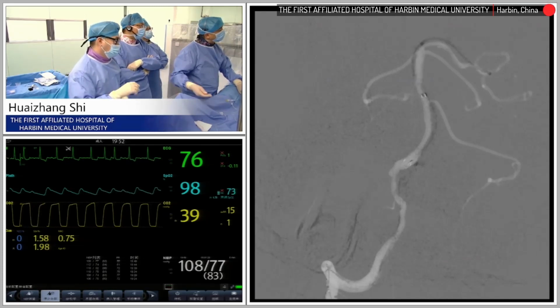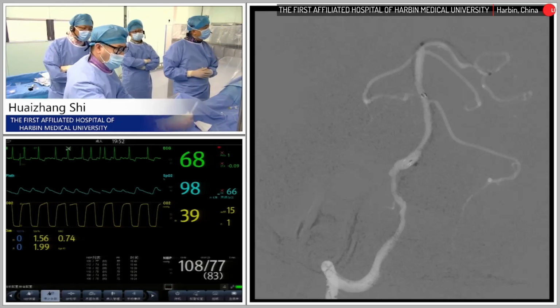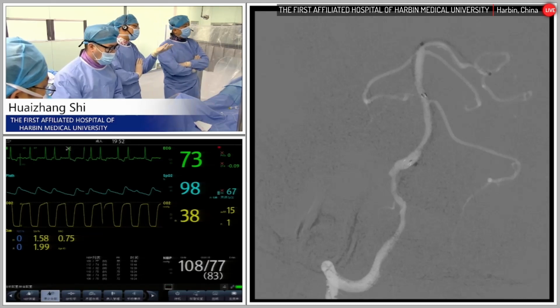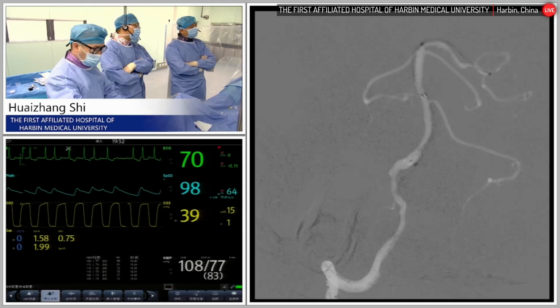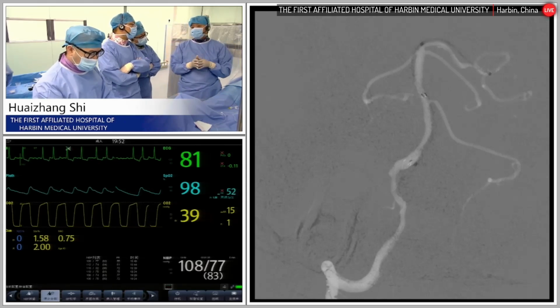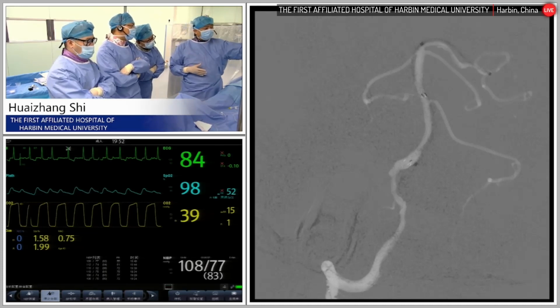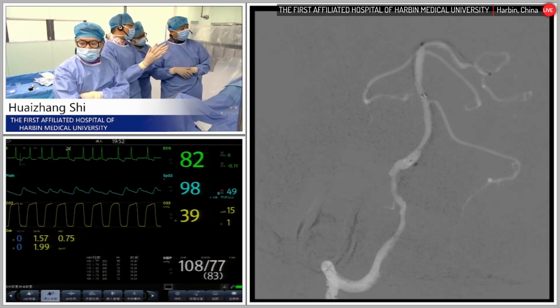Select angiography. Okay. 300. Transient. Prepare. Okay. Gateway. Angiography maybe. I will first try to push the catheter. If it's easy to cross the stent, it demonstrates it can make sure it's in the true lumen. If it's very difficult to cross this part, maybe it's from the closed cell. So maybe just dilation.